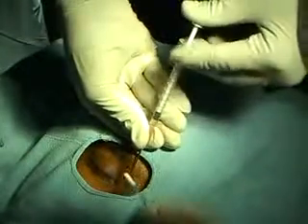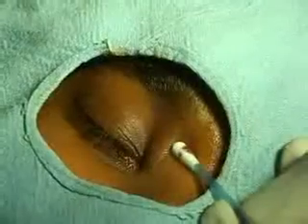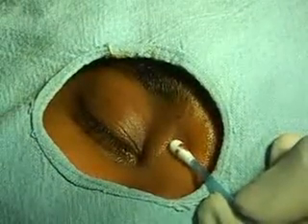A single 6-0 Vicryl suture may then be placed over the orbicularis and skin to close the wound. Alternatively, the wound may be patched. Routine postoperative care is advised for 1 week. In a few cases, we have noted partial resolution of the cyst and repeated the sclerotherapy with satisfactory results.